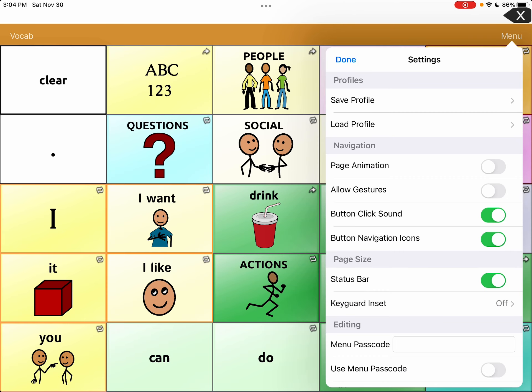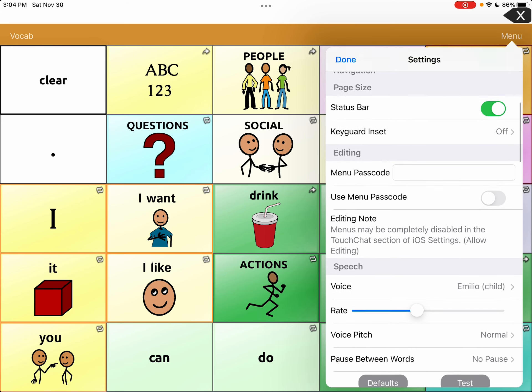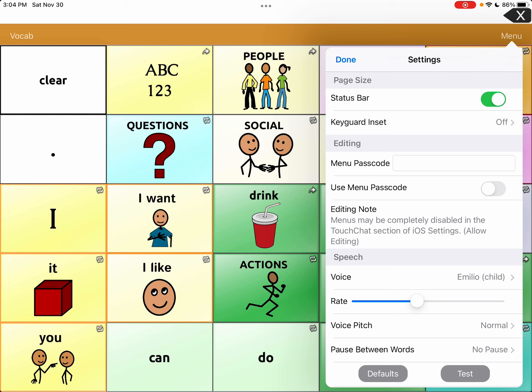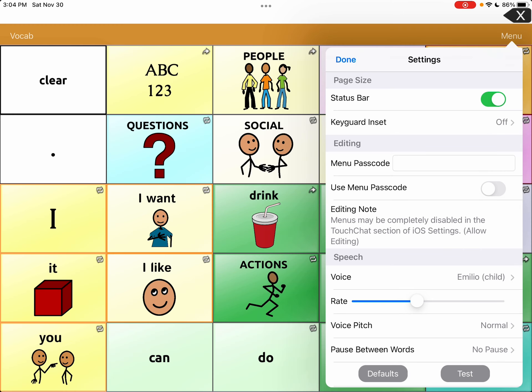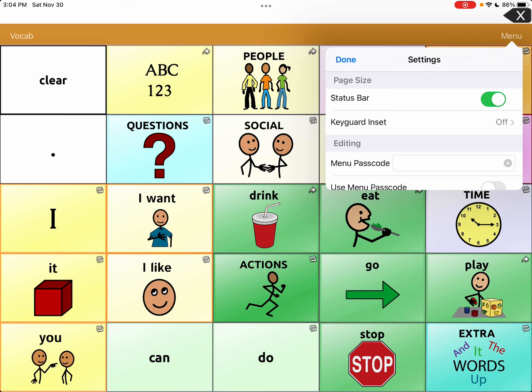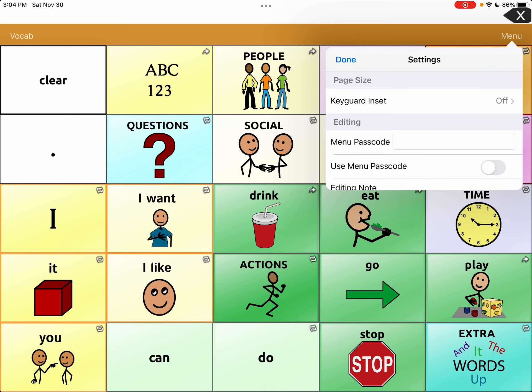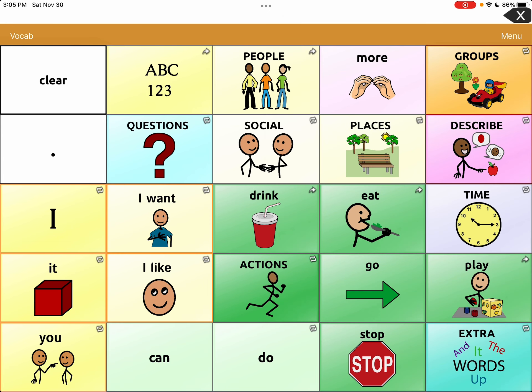Go to Menu, then Settings, and come down to 'Set Menu Passcode' and turn on 'Use Menu Passcode.' The password can't be blank, so enter a passcode — I'll do the same one I used before. I'm not sure if there's a limit on how many numbers you can use. Hit Done, and it's now turned on.